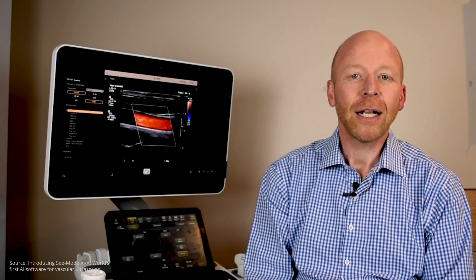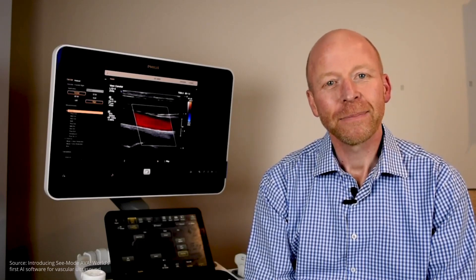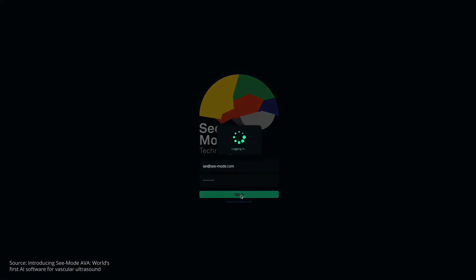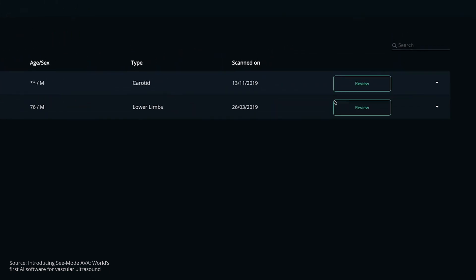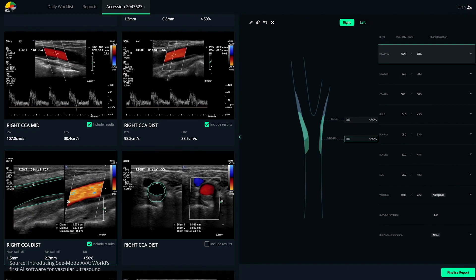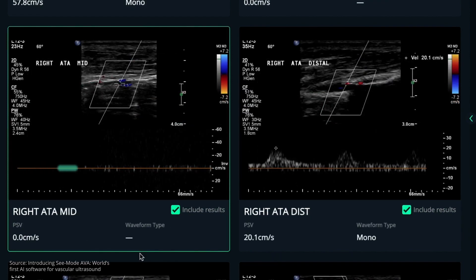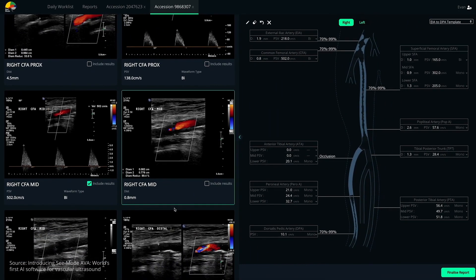Imagine an application that's able to analyse and report thousands of images every second. AVA, the next frontier in ultrasound, is awake before you — integrated into your current workflow, with each examination analysed before you start your review. Using artificial intelligence techniques tailor-made to suit the operator dependency of ultrasound, AVA analyses the full examination and detects clinical findings. AVA automatically detects and measures plaques in B-mode images, looks for stenosis or occlusions in Doppler signals, and analyses each colour flow image to make sure no sign of stenosis is missed. It wraps up all of those results into one cohesive, presentable diagram — and all of that happens before you even log in to AVA.